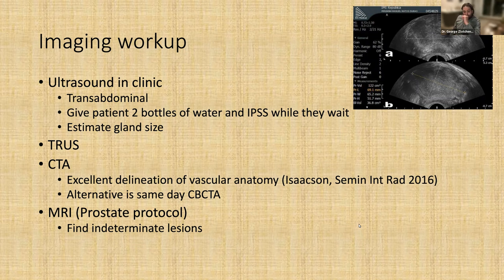So I have a special protocol that I found online where patients get sublingual nitroglycerin about 5 or 10 minutes before their scan, and then immediately when they're on the table prior to getting their contrast. It's great at showing you the anatomy, and I recommend, if you're starting off doing these, always make sure every patient gets a CTA. It doesn't always help you, but when it does, it's very helpful, because we'll go over some various anatomies, and it's good to know that in advance.